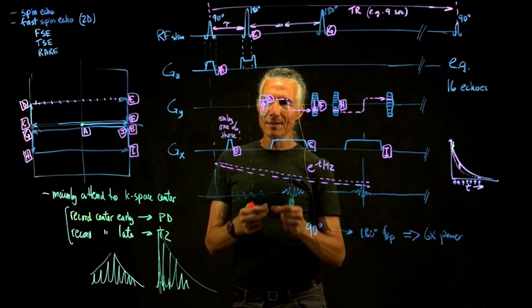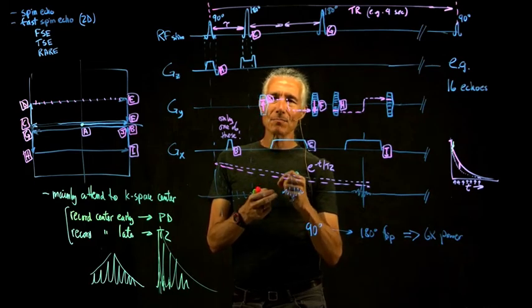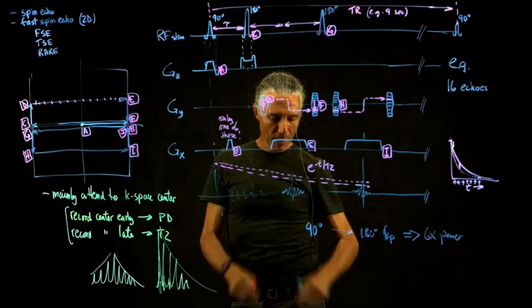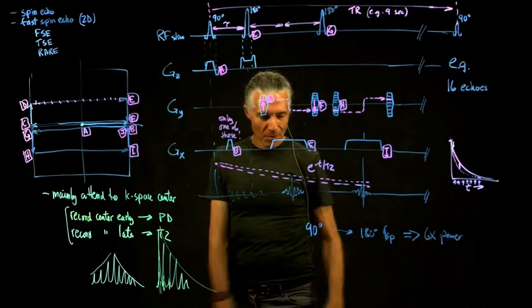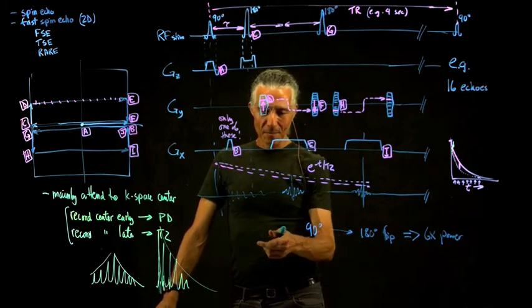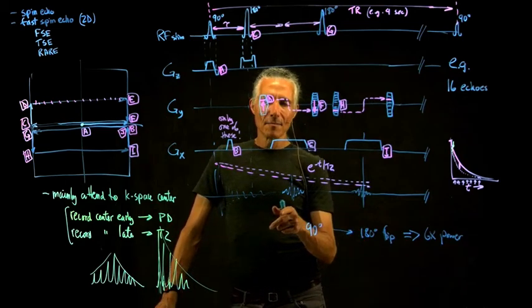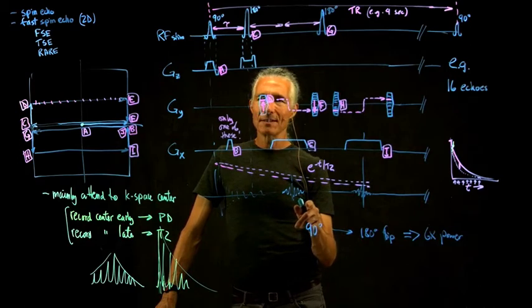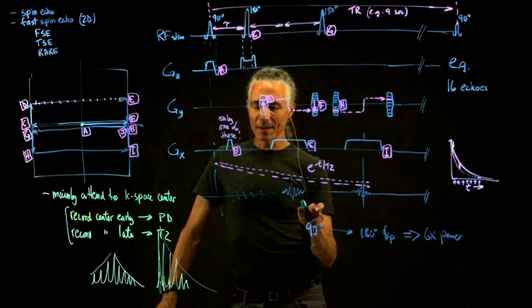diagnosis. One of the things that a thicker slice does is it blurs out small defects. And one of the problems with MRI is that it shows you so much stuff that most of it is kind of irrelevant. You'll see like a little blip here. Maybe there's a tiny stroke that occurred over here, or maybe there's a tiny little growth over here that's kind of irrelevant, or maybe a little cyst. So you'll see a bunch of little tiny things.